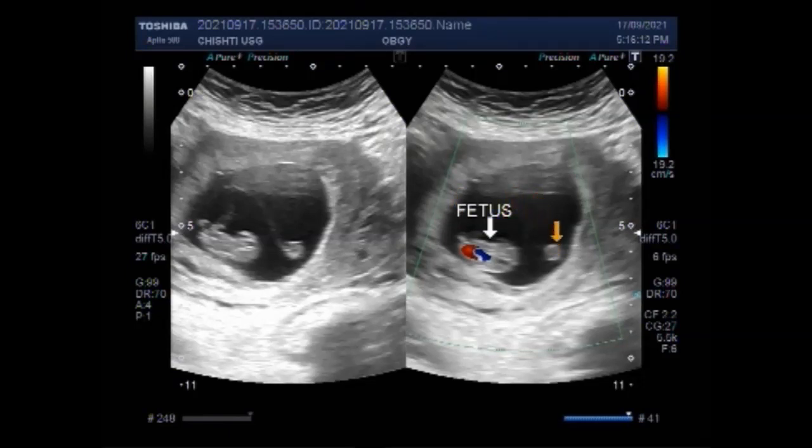So again, you can see the blood flow in the fetus. In one gestation sac, the other gestation sac is empty, devoid of any fetal pole in it. So it is the anembryonic pregnancy or blighted ovum. The other fetus is echo-normal with blood flow and fetal cardiac activity seen in its interior.